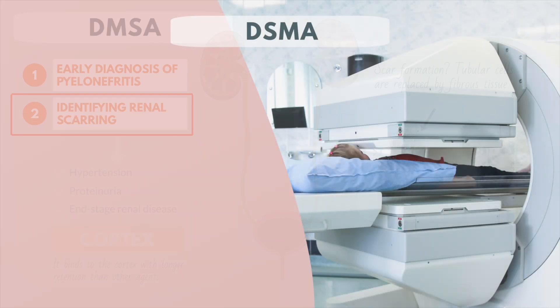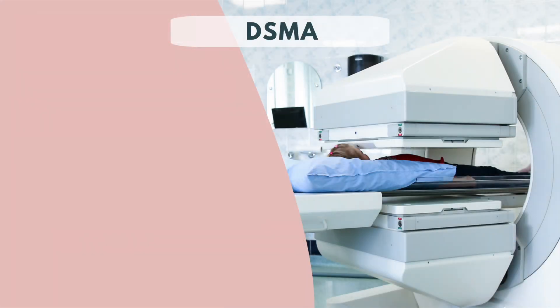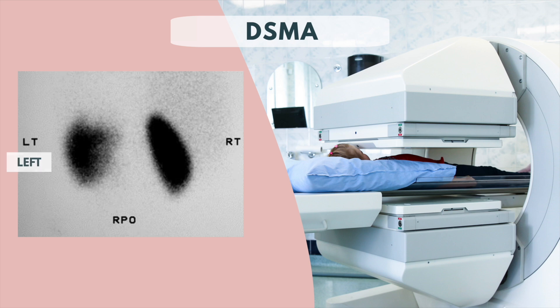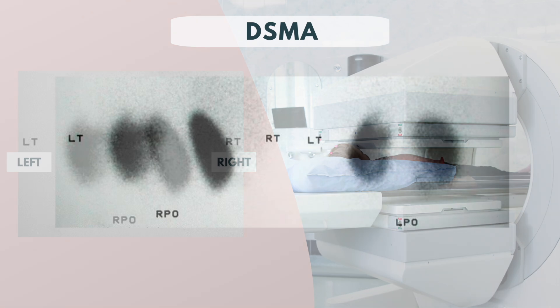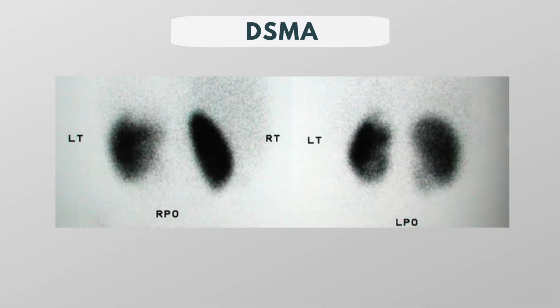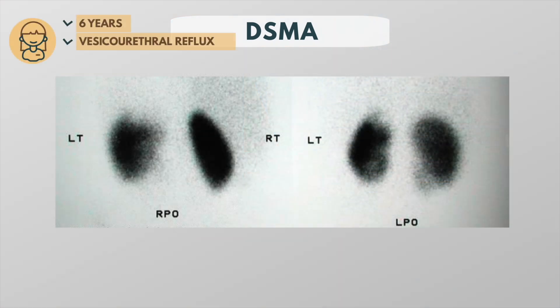Let's look at an example. Note that the camera is usually placed behind the patient for imaging, so the image of the left kidney is on the left and the image of the right kidney is on the right. This is a scan from a six-year-old girl with known vesicoureteral reflux who had multiple urinary tract infections.